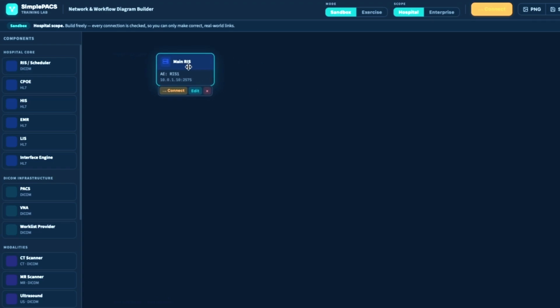Now, once that order is digitized, and you always want to think about this in terms of workflow, what would be the next step? Well, the next step would be the actual acquisition itself. But let's not jump to bringing the patient into the room quite yet. Remember that we've entered everything in the radiology information system, but the language, if you will, of that radiology information system is HL7.